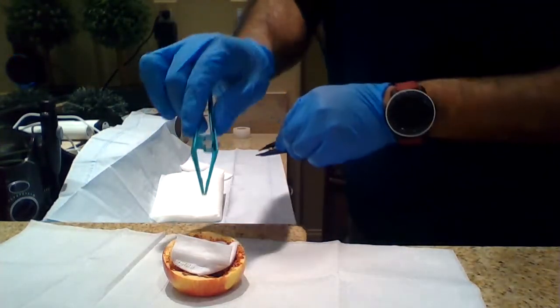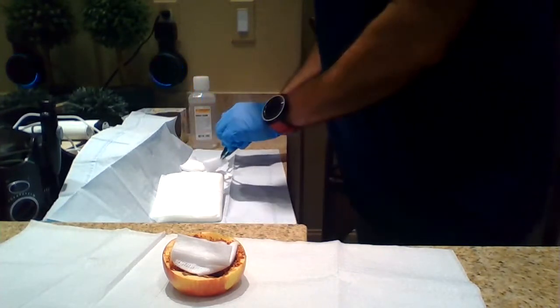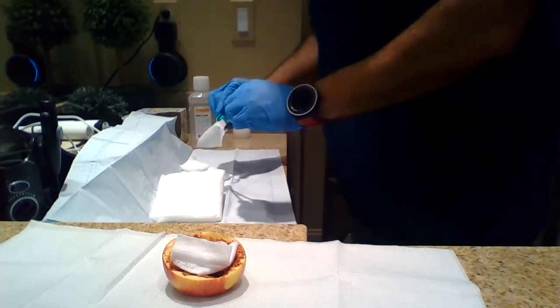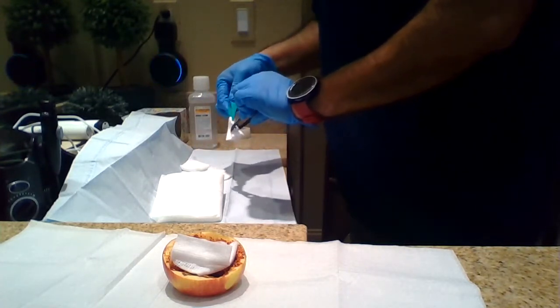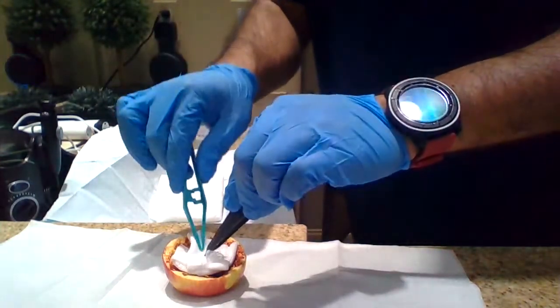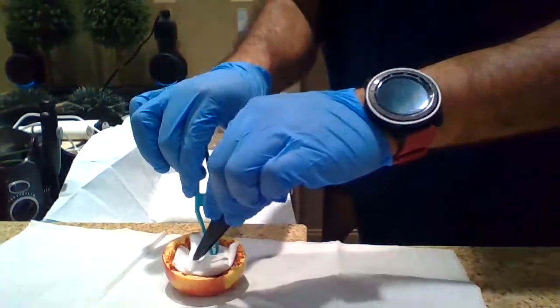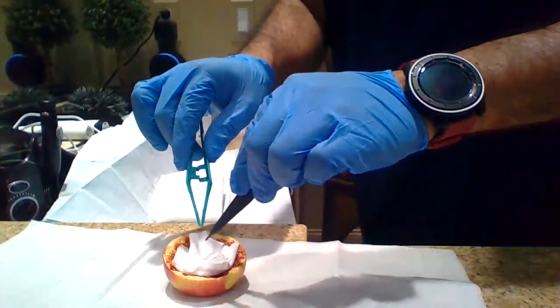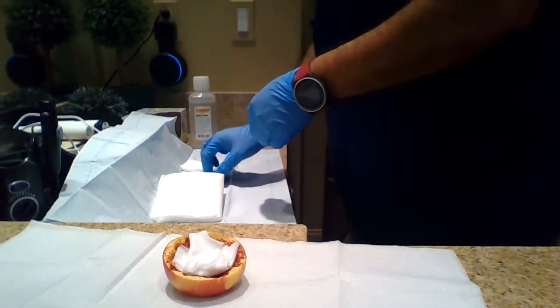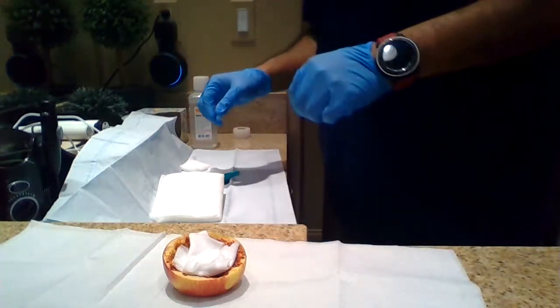But again, make sure the sterile doesn't touch the outer edge. So pack it nice and good. Okay. So that looks like a really good packing actually.